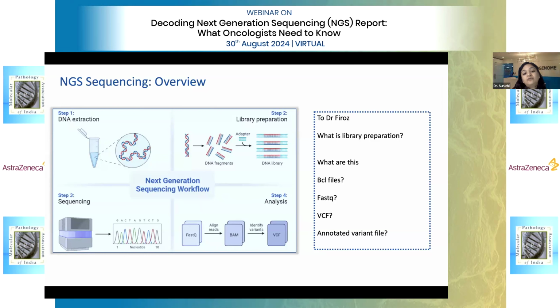Can you see the quality of the tissue in your H&E slide? No, we cannot. Quality will be known only after we do the analytical steps. All that you need is a tumor content, whether it is more than 30% or not. Is 30% good enough or is 10% good enough? 10% is validated as good enough. Ideal is 20% or more. Okay, fair enough.